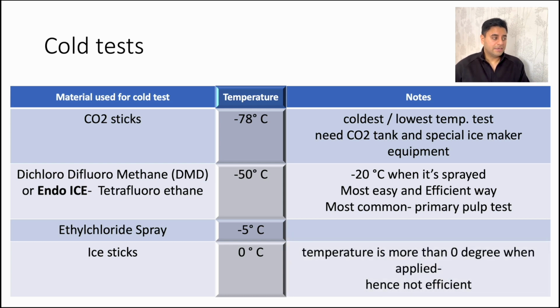After Endo Ice, ethyl chloride spray has totally gone out of the market. We don't see it very often anymore, but if it is in the market, then yes, it's something that you can use instead of Endo Ice. I did not find any disadvantages for using ethyl chloride. It's just that it's not used anymore in the market. Endo Ice has completely taken over because it's way more efficient to do with Endo Ice.